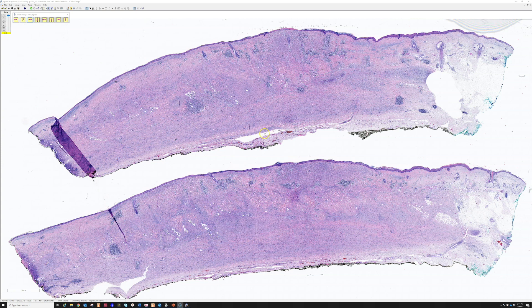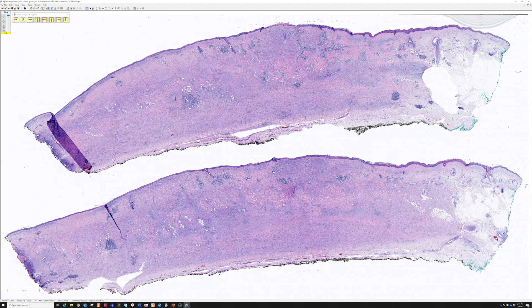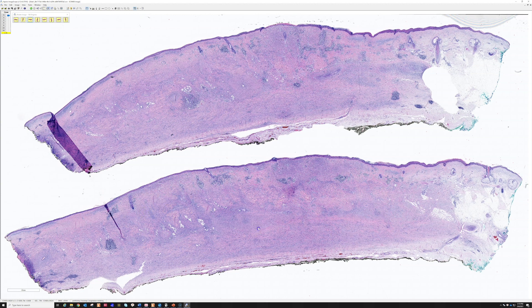This is case one - an 80-year-old man with a scar-like plaque on the scalp. From low power, someone has probably called this malignant on a biopsy, because otherwise we would not be getting this massive slab of tissue going from the epidermis all the way down to the galea aponeurotica, right next to the periosteum of the skull. The dermis and subcutis are basically totally wiped out by this process.